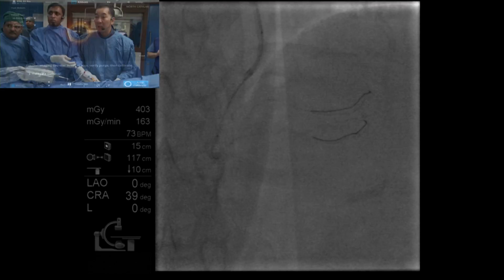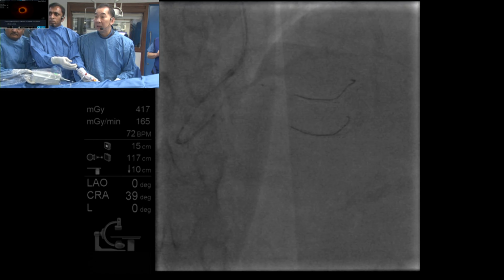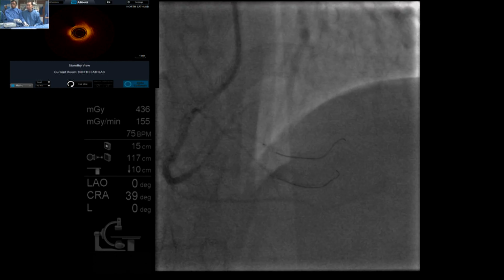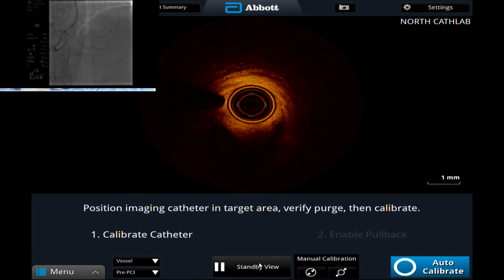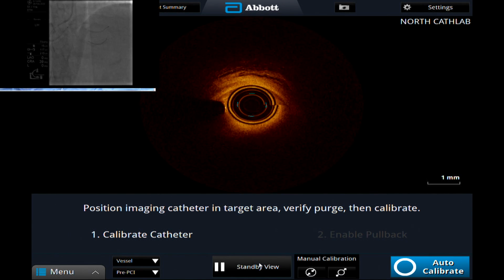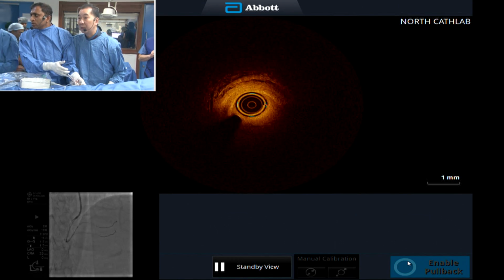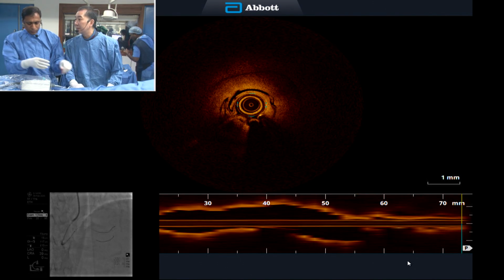So we've got Dr. Akasaka here with us, and he's joined us on the podium, so it's going to be great. What do you think here, Doctor? It's okay, a little bit distal, but fine. The guide is sitting really well. You ready for me? Good, go. Pull back, right. That's very fine, very good.